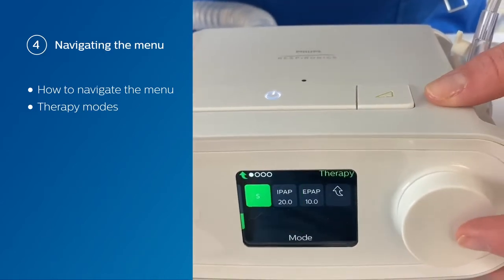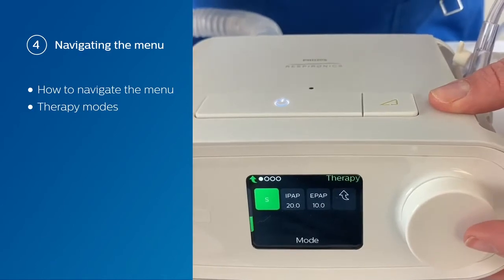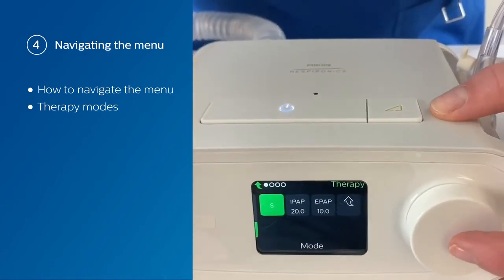We're going to go through S mode — that's another one of the options. In S mode, that's a spontaneous mode where you don't set a mandatory rate; you just set an IPAP and an EPAP.